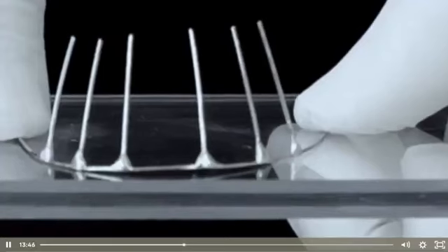And look at this. What we can see now is that the strips are angulating towards the center, meaning we have here what we call the wagon wheel effect. So we have a torsion in the cross section of this rectangular wire that has the shape of an arch in the anterior segment.